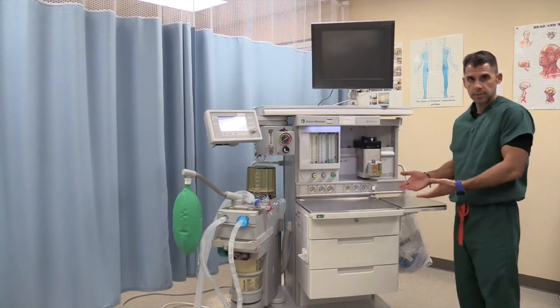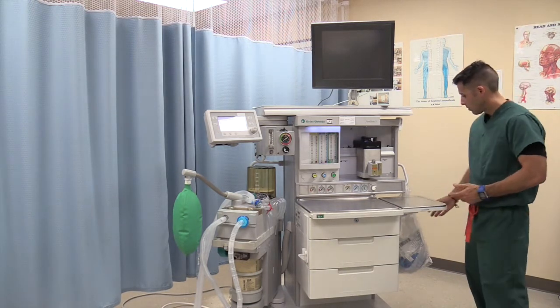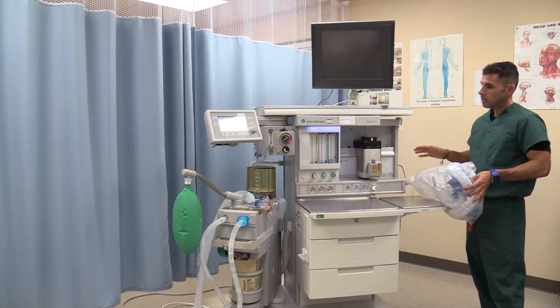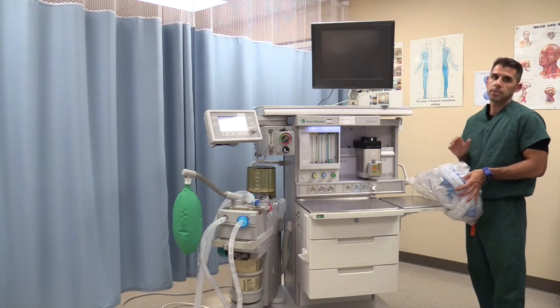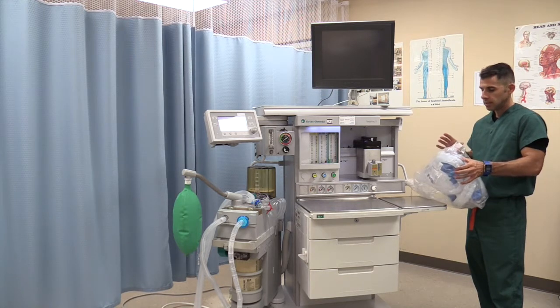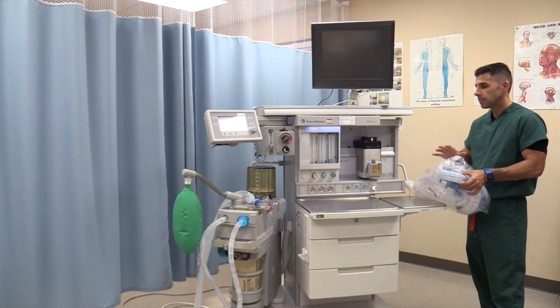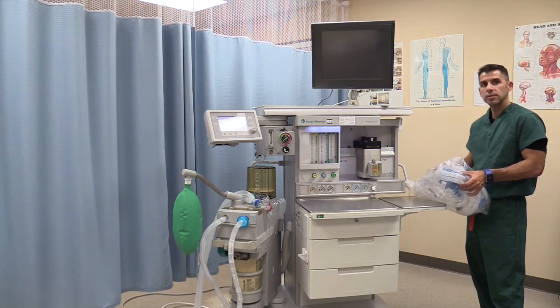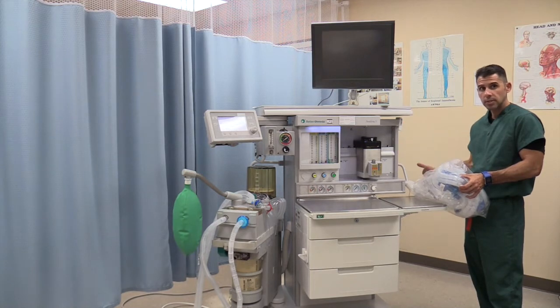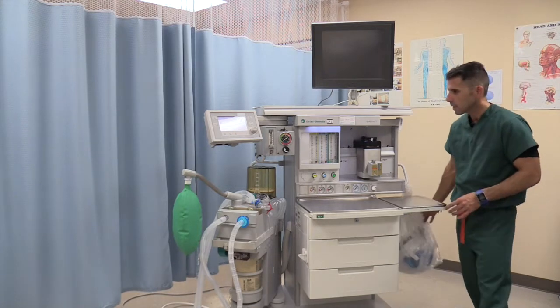We've come to the front of the machine, and I'll be talking about certain characteristics of the front. The first and most important thing is your AMBU bag. If you have a failure in your anesthesia machine, never forget the importance of delivering oxygen via an AMBU bag. Before I go on and check anything else, I want to make sure there is an AMBU bag. It is usually located either in the back or on the side of the machine.